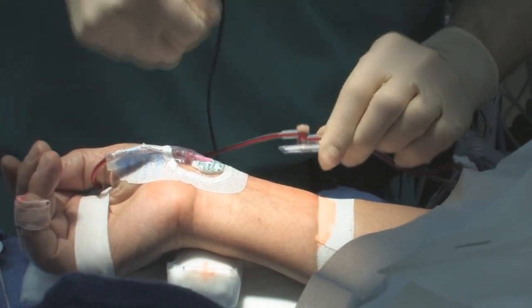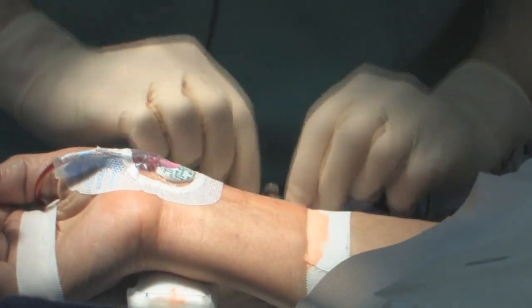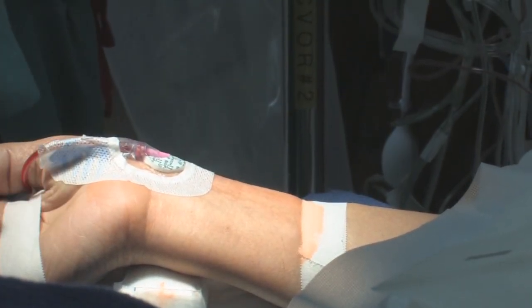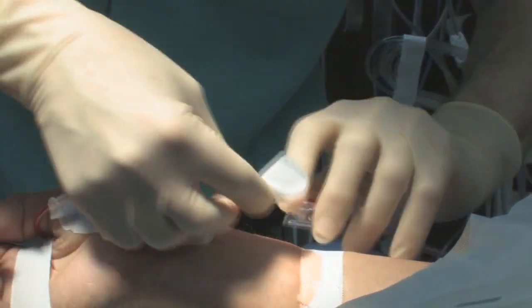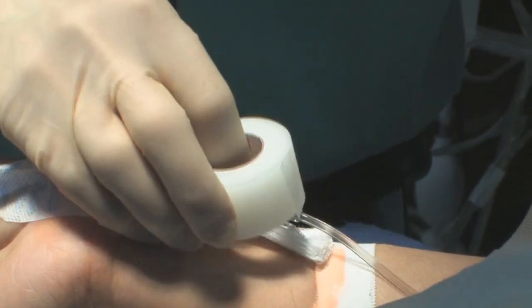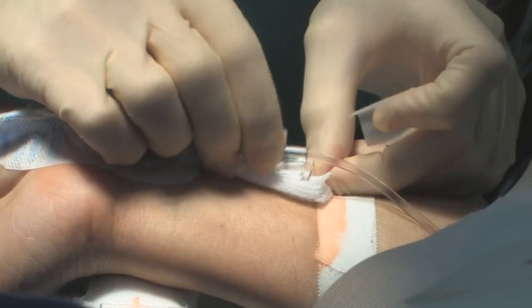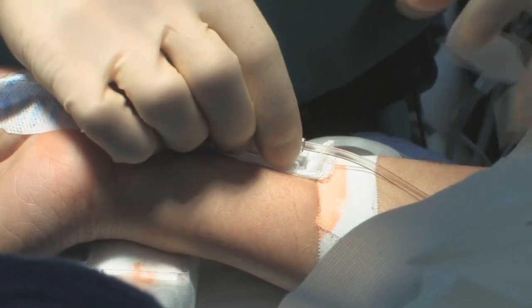There's a little port on the vamp so nurses can draw blood in the ICU — don't occlude that. When the arms are tucked, I don't want the line digging in, so we take a couple of two-by-twos. Take one two-by-two and fold it longitudinally so it goes underneath the line, then take a little tape — get it secure and nice so it pads well.